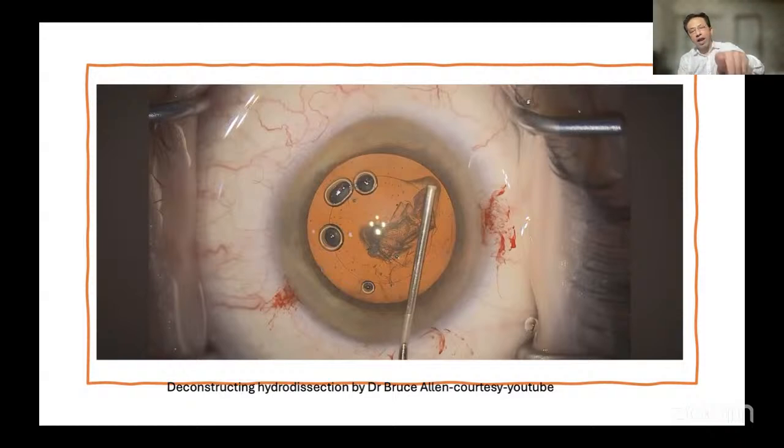So the cannula is directly abutting against the entire span of the nucleus, and you're injecting the fluid at the distal end. What happens here is that when you pass the fluid, the nucleus comes out, and you are at risk of blocking the nucleus. If you don't do a posterior decompression at that point, there is a higher chance of building up capsular block syndrome.